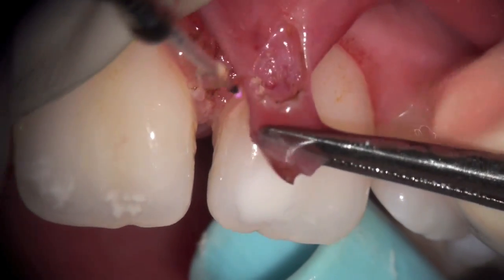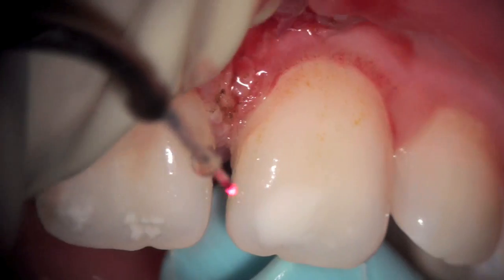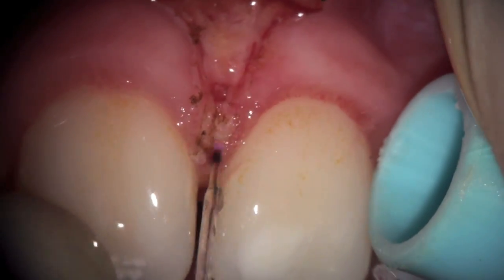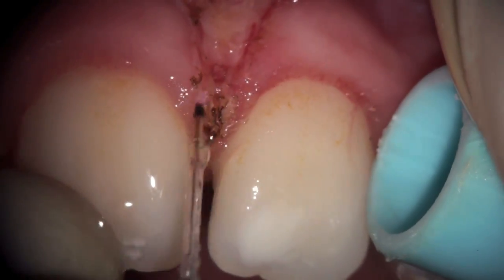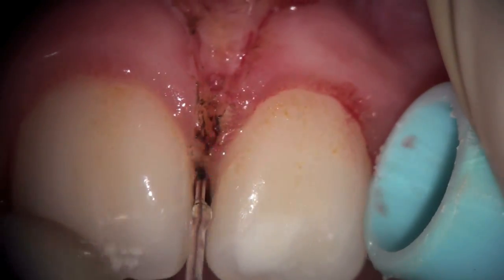I actually left a little bit — I should have removed a little bit more. You can see it's actually fairly vascular, bleeding a little bit more. We go back in and remove some more of the fibers that were going right in between the teeth, using continuous wattage with a fine water spray.